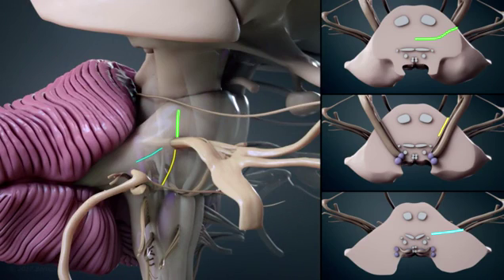The supratrigeminal safe entry zone is placed immediately above the root entry zone of the 5th nerve, while the peritrigeminal safe entry zone is located between the takeoff of the 5th and 7th 8th nerve complex. A workhorse used at the Barrow Neurologic Institute is the middle cerebellar peduncle safe entry zone. The orientation of the incision for this safe entry zone is in line with the direction of the fibers traveling through the middle cerebellar peduncle. This safe entry zone can be readily used to access deep pontine lesions with minimum morbidity to the patient.